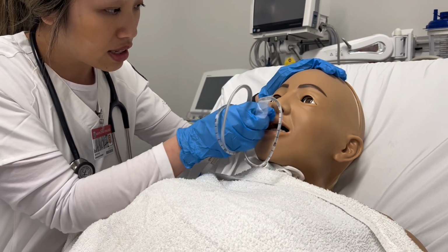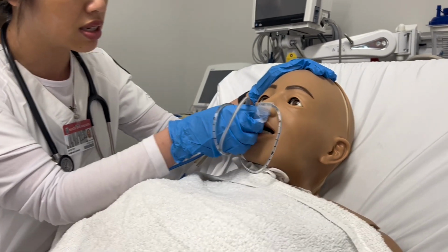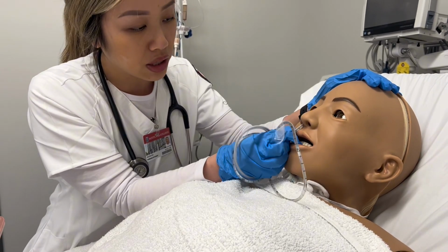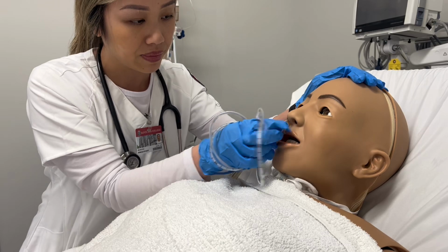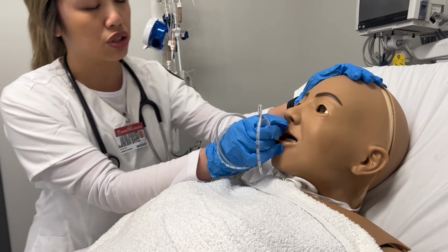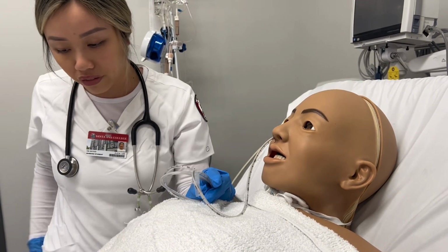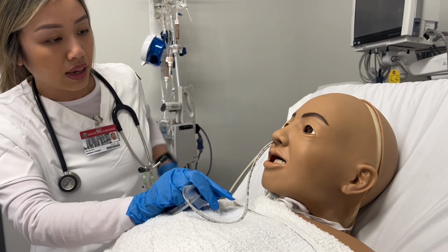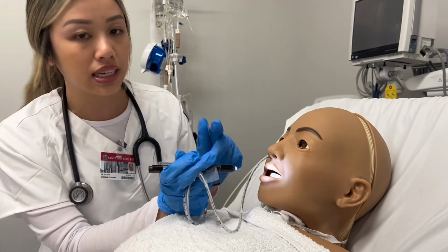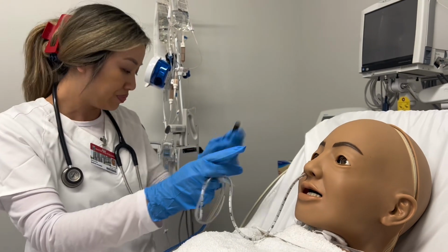If I meet a coiling or anything like that, or I'm having difficulty, I would take the tube out, or I would back the tube up, and then redirect and advance it again. Once I reach the pharynx, I'm going to have Mr. Smith tilt his head forward from chin to chest. Okay, Mr. Smith, go ahead and tilt your head forward from chin to chest. And then I would check as well, making sure that everything looks good. If I notice any type of gagging, I would open the mouth and assess the back of the throat.